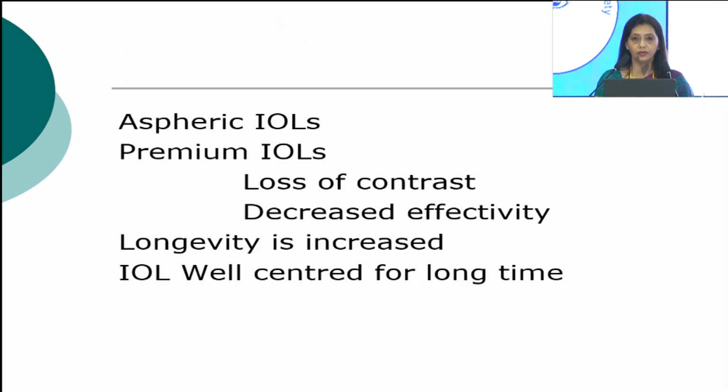As we all know, with the increasing use of aspheric and premium IOLs in today's surgery done by all able hands, there is loss of contrast, which leads to decreased effectivity already. So with all these IOLs, if the glare and halos of a decentered IOL add up, it causes a lot of problems for the patient. So it is our responsibility when we use these premium IOLs that we have a very centered and good IOL. As the longevity of the patient has increased, we need an IOL well centered for the longest period of time.